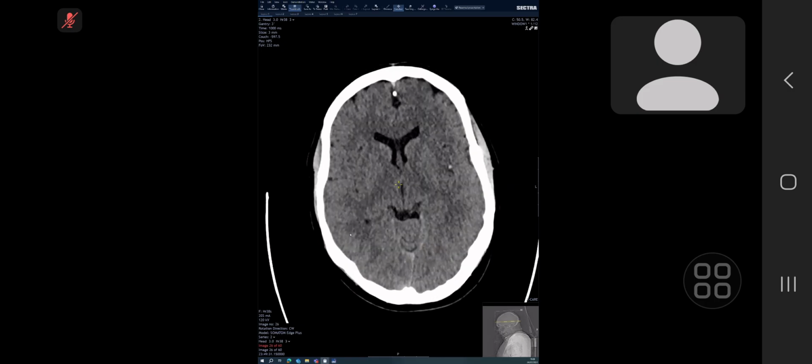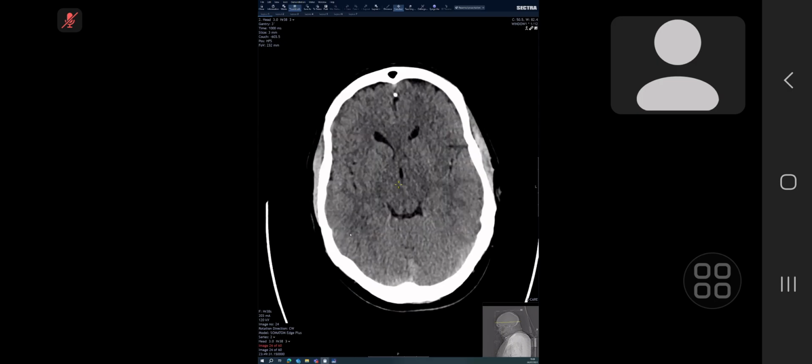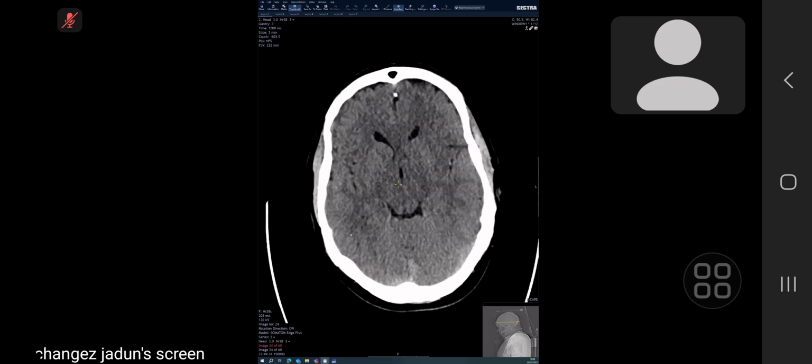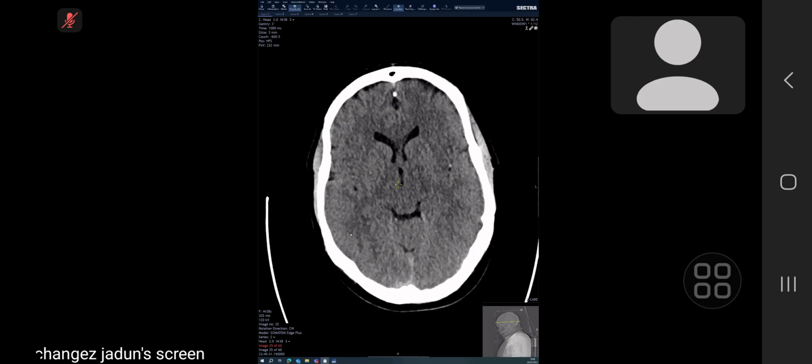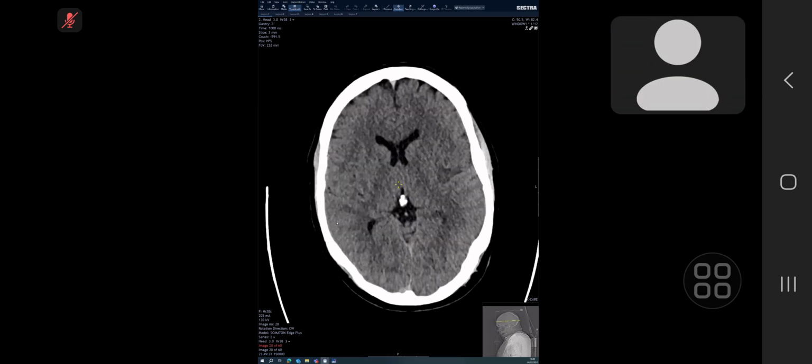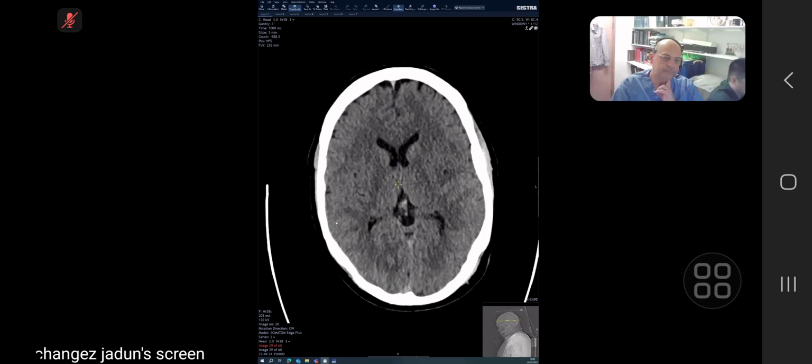I would like to see any. Here, please stop here, sir. Some upward, more upward. Yeah, here I can see in the left there is a hyperdensity. There is a center, a dot hyperdense area. Please some upward. Yeah, I can show. Yeah, few slices below, sir.